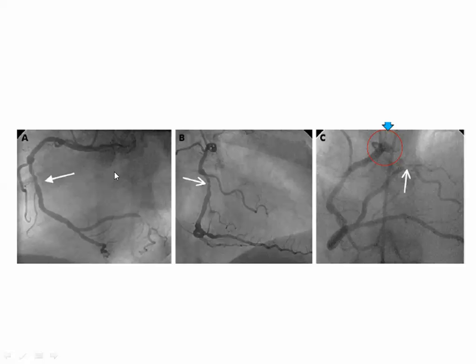So what the walls? Septum, anterior, lateral, inferior. This is inferior. While this is the continuation of the LCX, the PL, to communicate with the LCX. Okay? So this is the PDA. This, and can you see the septal perforators? This is the septal perforator. While this is the SA nodal, the AV nodal branch. Okay? This is small branch. So this is the PDA and this is the PL.